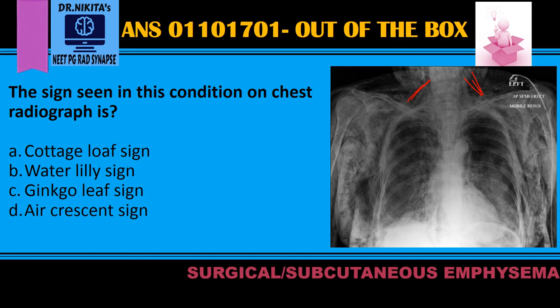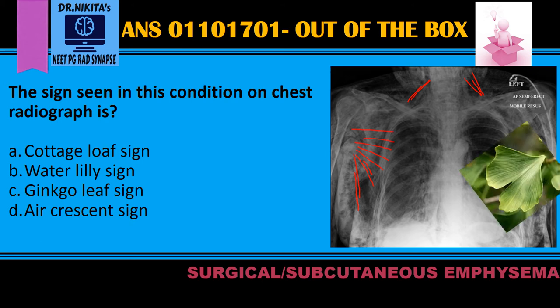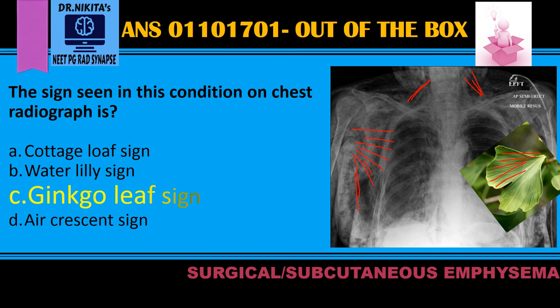To identify the sign, what you see here is the Pectoralis Major Muscle — it also contains this air. Those are the black striations in the Pectoralis Major Muscle, which is similar to this Ginkgo leaf. The Pectoralis Major Muscle with these striations, the black lines resembling air — that is the Ginkgo leaf sign seen in surgical or subcutaneous emphysema.